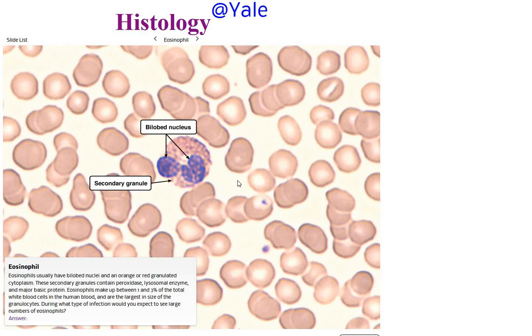Or if you have an asthma flare-up, something like that, these cells are going to be very active in that response. And their other function is they're going to defend against bacteria and parasites. So these eosinophils can actually release toxins to kill off parasites if they are detected within our system. So pretty cool. Very hard to find on a slide. So that is less likely to appear on the lab exam, but it's a good candidate for a PowerPoint question.